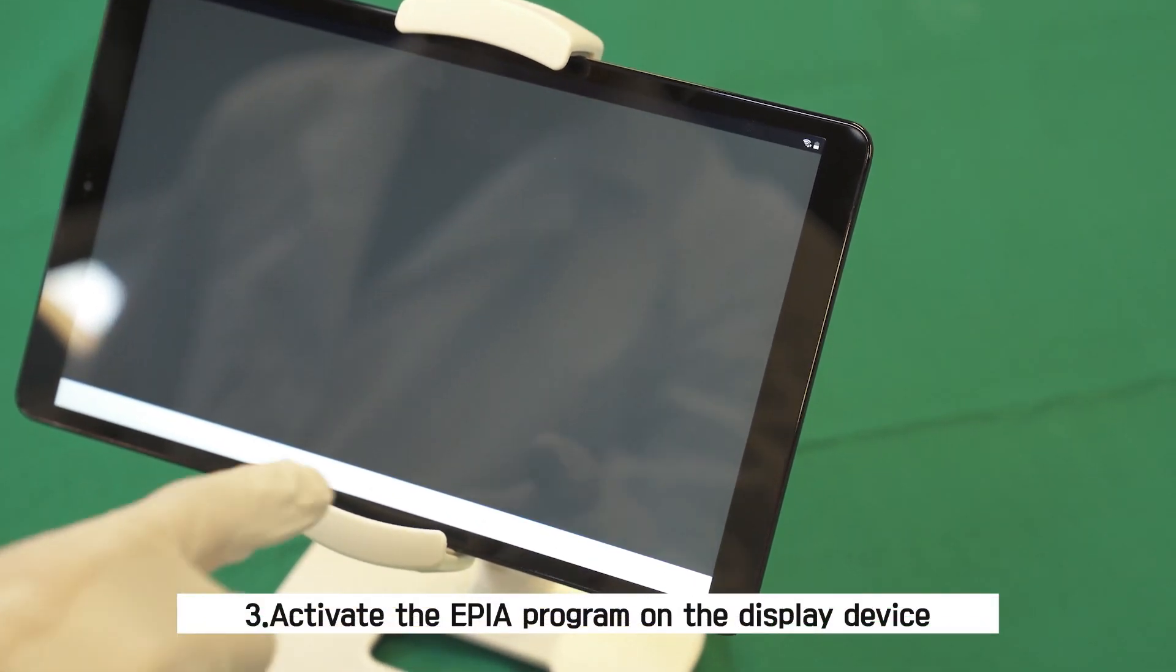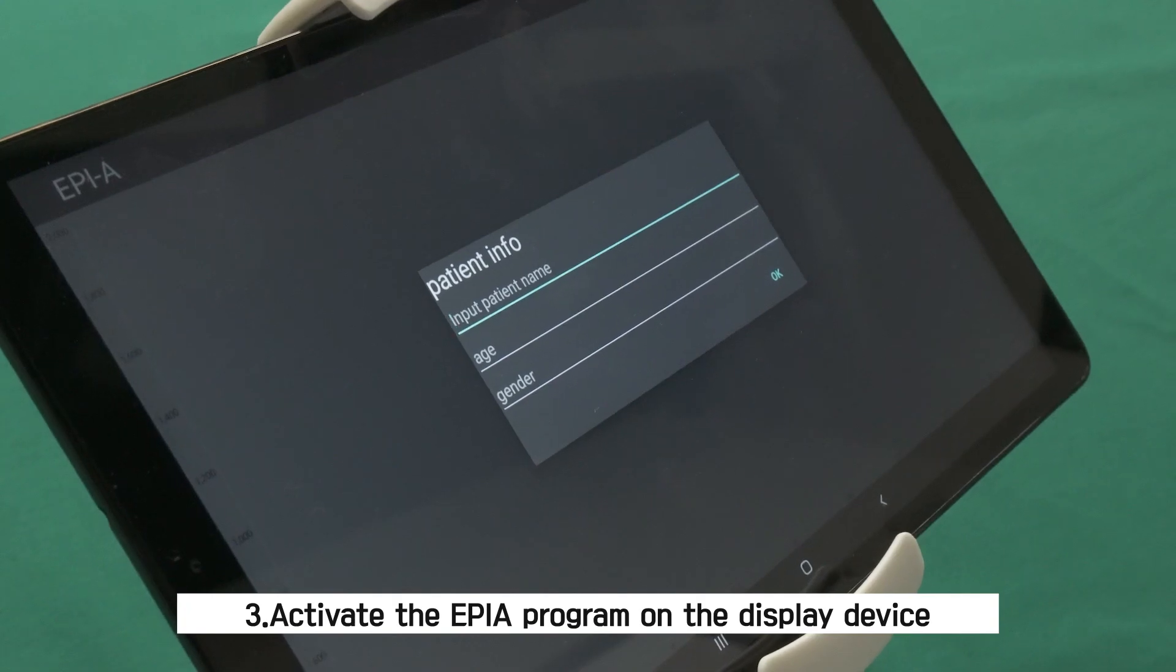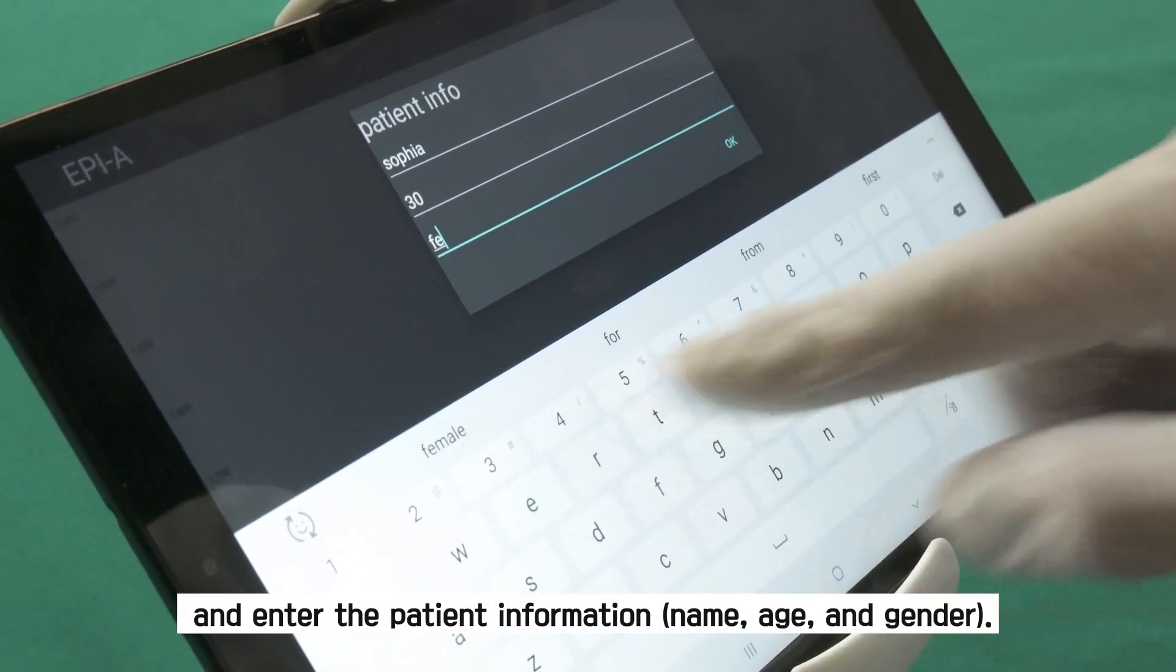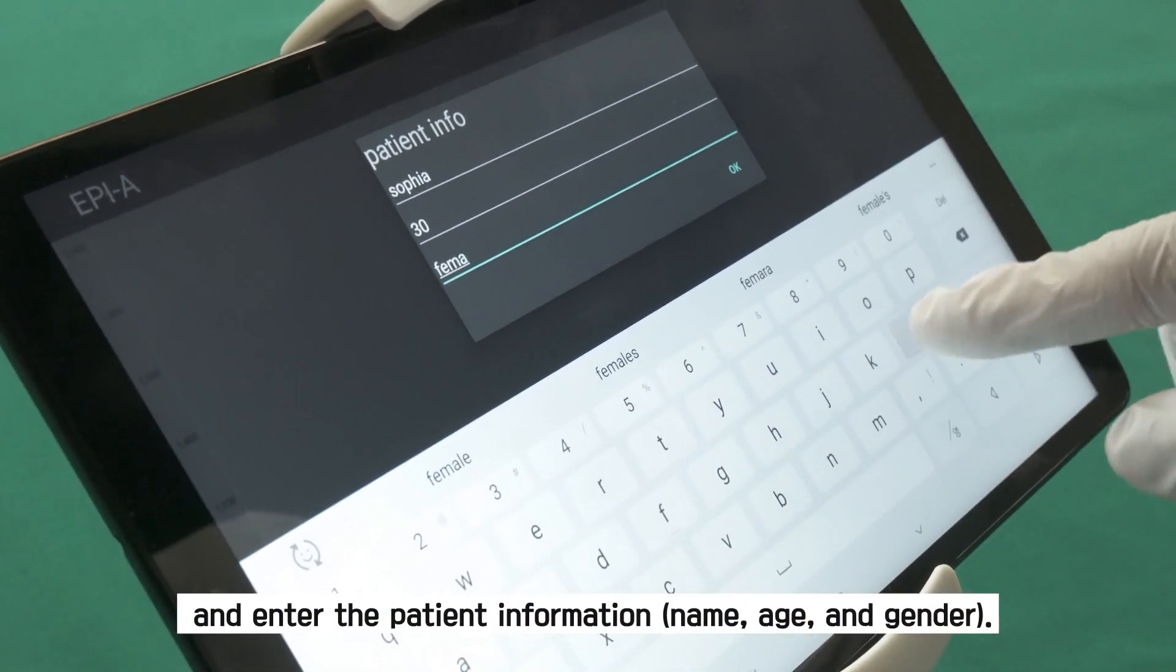Third, activate the EPIA program on the display device and enter the patient information like name, age, and gender.